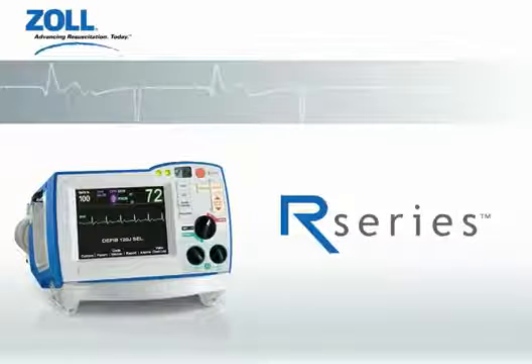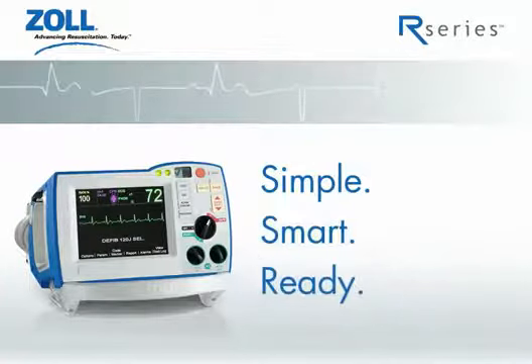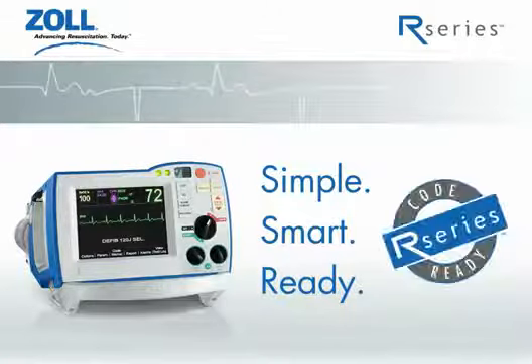The R-Series is the first and only defibrillator designed around the 2005 guidelines. This defibrillator is simple, smart, and ready. In fact, it's code ready.